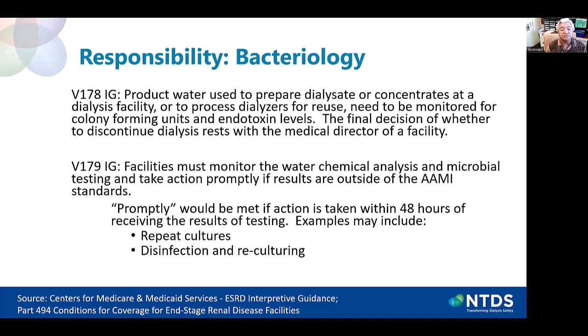The balance between these two risks will depend on the level of contamination and time of exposure on the one hand, and the medical condition of the patient on the other hand. Because this balance will almost certainly vary from circumstance to circumstance, the final decision of whether to discontinue dialysis rests with the medical director. Facilities must monitor the water chemical analysis and microbial testing and take actions promptly if results are outside of the AAMI standards.